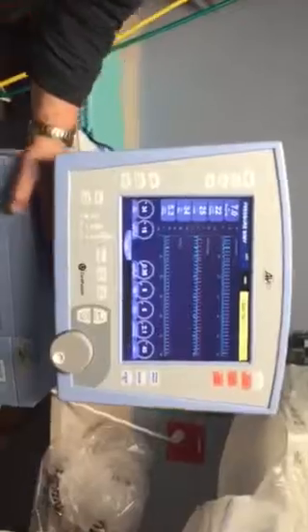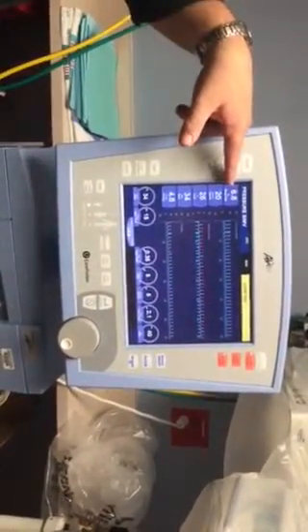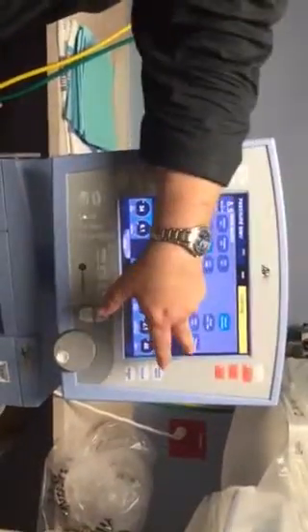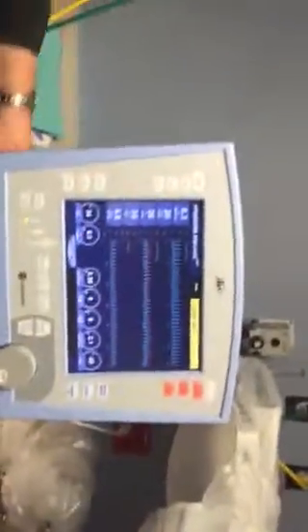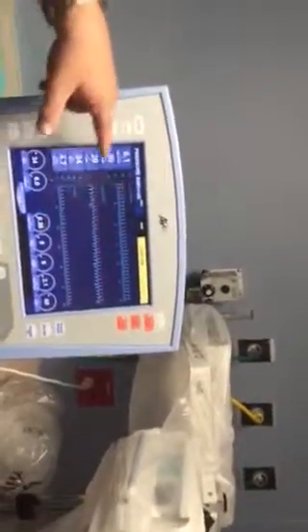If I want to make a change, all I have to do is come out of volume guarantee, and I'm back into pressure ventilation. Dial that down. So let's say my baby's CO2 was really low. I'm giving too much tidal volume. And then there's my new target tidal volume. Go back into volume guarantee, and my new target is now 6 cc's instead of 7 cc's. And this will eventually move down. You'll see my pressures will move down a little bit until this reads 6.